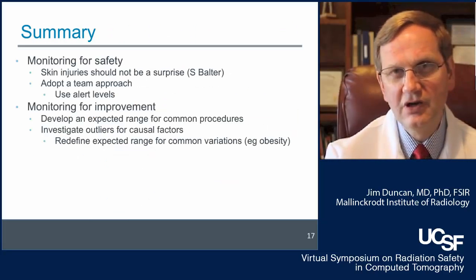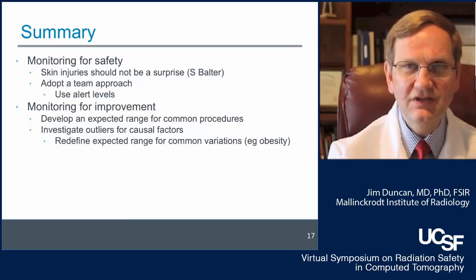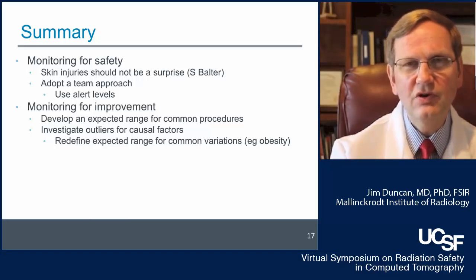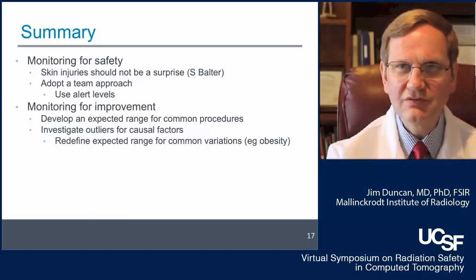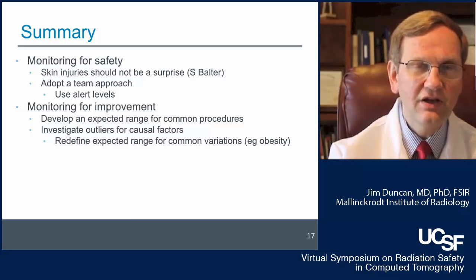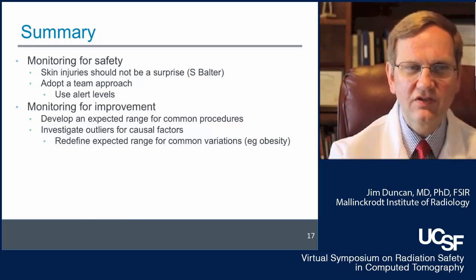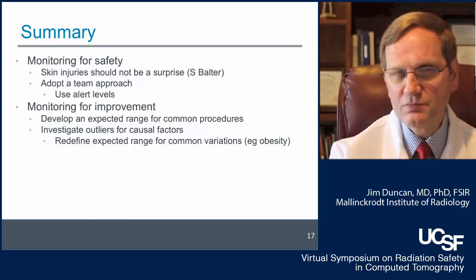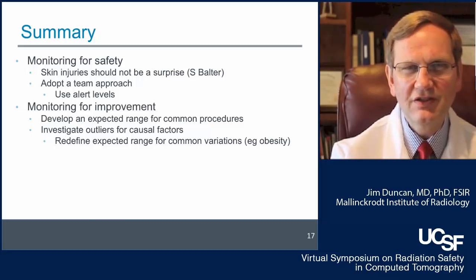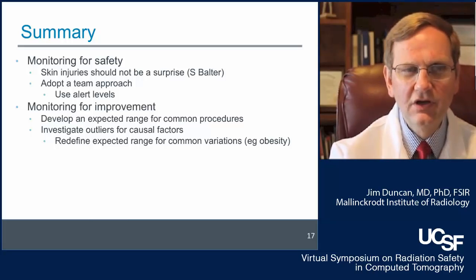So in summary, we should be monitoring for safety. Skin injuries are difficult to avoid in the most complex procedures, but they shouldn't be a surprise, through a combination of intraprocedural monitoring and reflection at the end of a case. We need a team approach because intraprocedural monitoring is difficult for the primary team. This is where the techs really help us out.